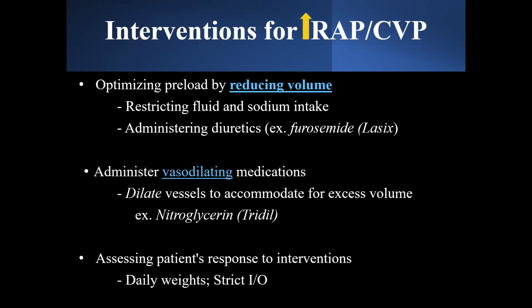And I see the CVP go from 30 down to 15. What a beautiful response. And what a very visual way to see that your interventions were effective. So that's how you're going to evaluate the effectiveness of your response, is taking a look at those numbers. You don't just go, oh, all right, so the CVP is 30 and you move on. No, you do something about it and then you reevaluate to see if what you've done has been effective.